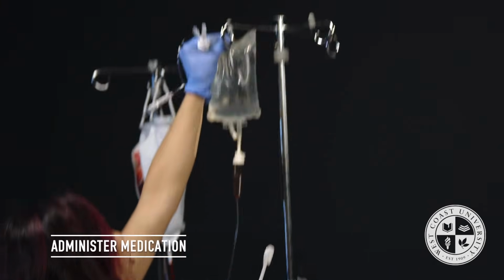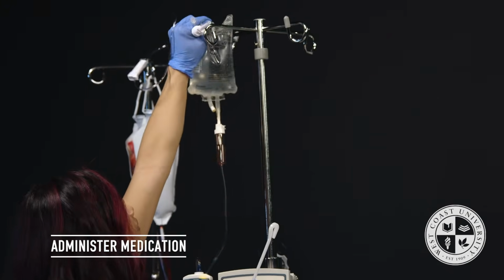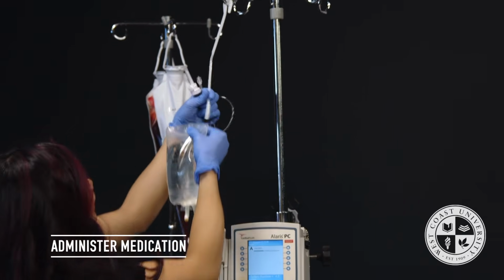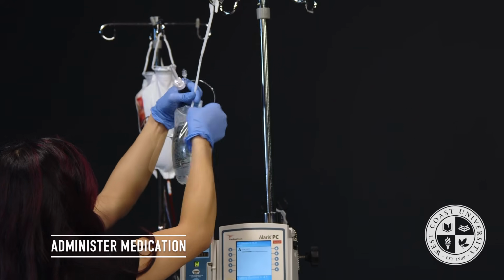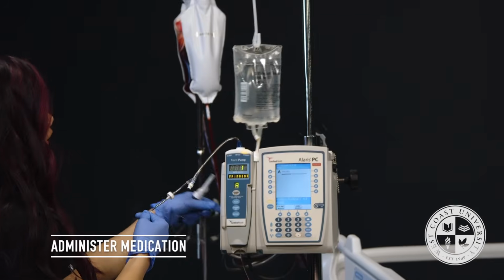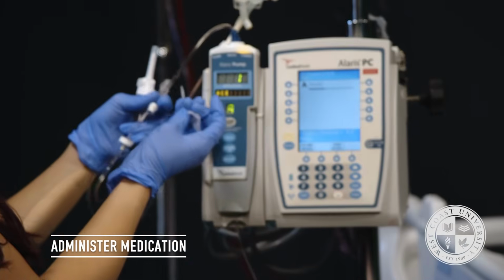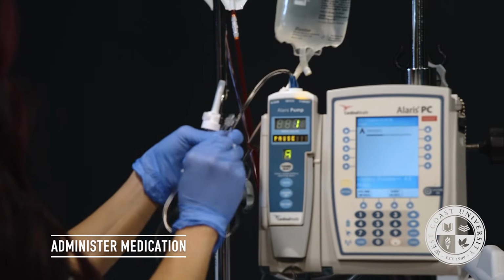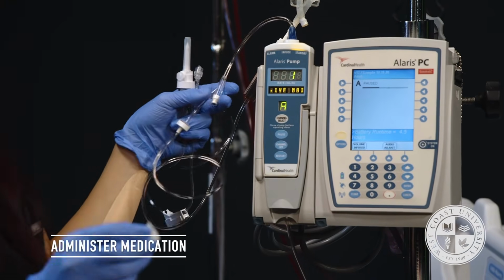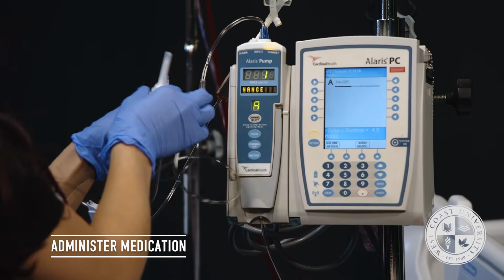I'm going to go ahead and lower my primary bag. I see that it is sodium chloride and it's infusing at the right rate. I'm going to go ahead and hang it. I'm going to go to the port closest to my primary bag, and I'm going to use one of my alcohol wipes to scrub the port for at least 20 seconds. Allow it to air dry.